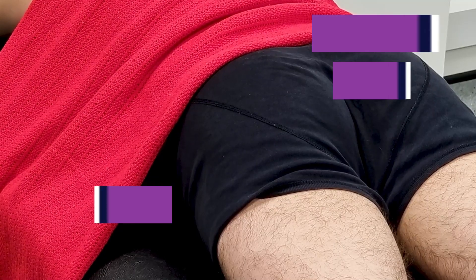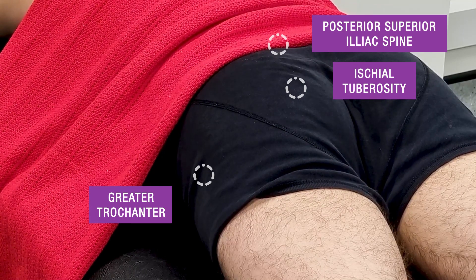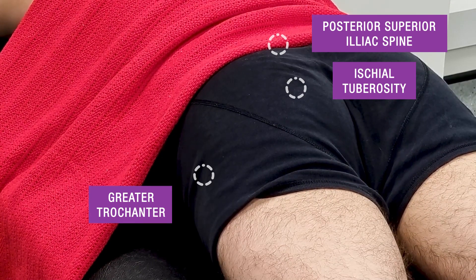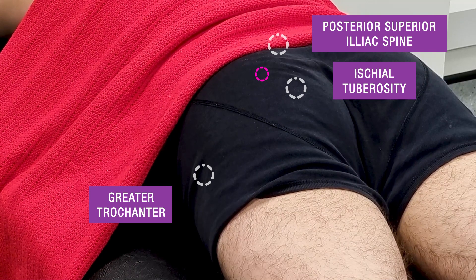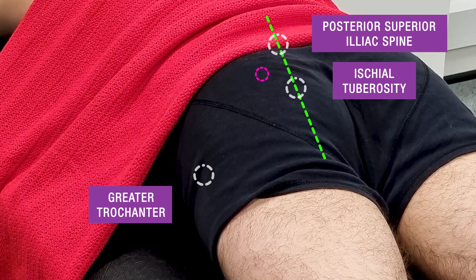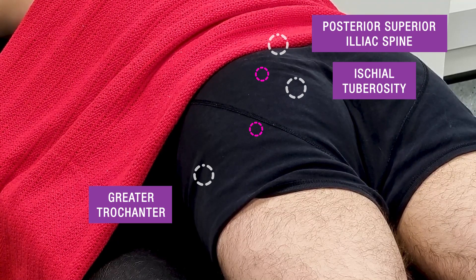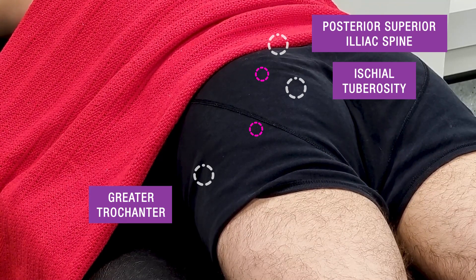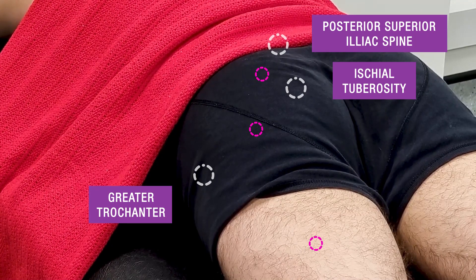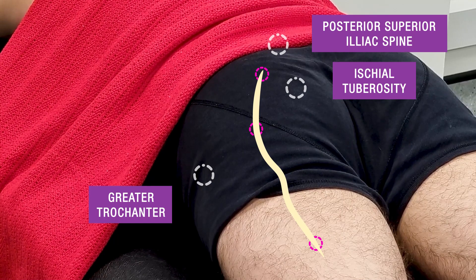Now that we've identified those three bony points on the posterior thigh we can use them to map the route of the sciatic nerve. In order to do this we're going to have to mark three extra imaginary points. The first point is around two centimetres lateral to an imaginary line between the ischial tuberosity and the posterior superior iliac spine. The next point is around halfway between the greater trochanter and the ischial tuberosity, and the final point is around two-thirds down the back of the thigh. If we join these three points together we can map out the approximate route of the sciatic nerve.